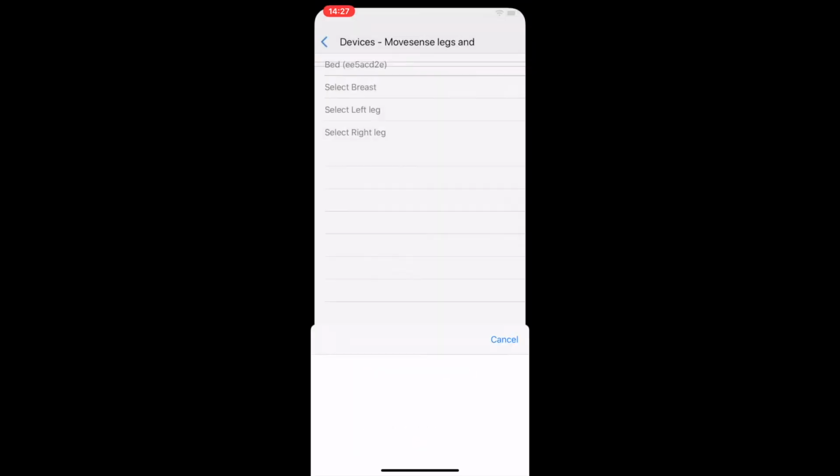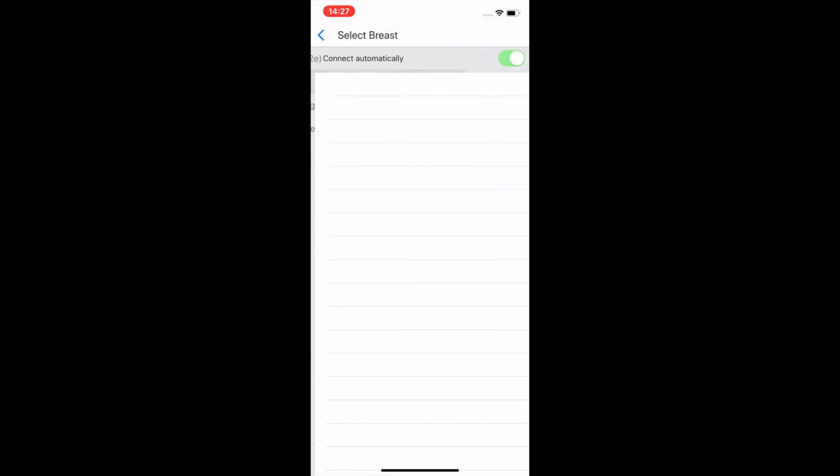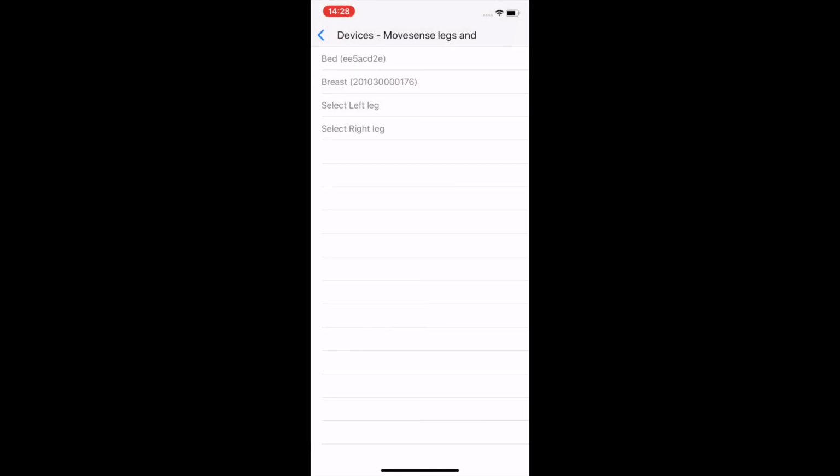So the same thing again, selecting the bed, taking the bed sensor, then we obviously need to put on the breast belt and put it around. With the breast belt we could also add movement, acceleration, but this time we just decided to take ECG. But obviously if you want to track a certain position in bed over a certain period of time, you can do that as well. So the breast belt is chosen.